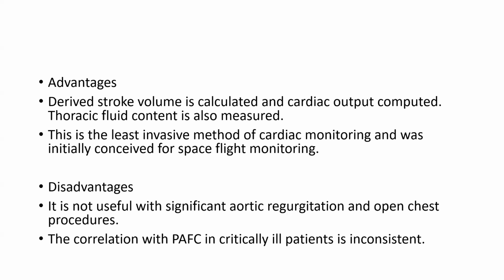Advantage: derived stroke volume is calculated and cardiac output measured. Thoracic fluid content is also measured, and this is the least invasive method of cardiac monitoring and was initially conceived for space flight monitoring. Disadvantage: it is not useful for significant aortic regurgitation and open chest procedures. The correlation with the pulmonary artery flotation catheter in critically ill patients is inconsistent.